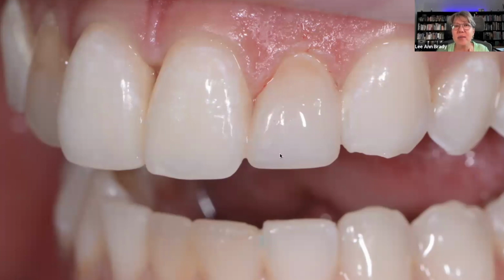Okay. And that it's not a sharp line across, right? It's got that character of dentin. You can see where I'm adding in surface morphology. She doesn't have a lot of natural surface morphology. So I'm just keeping this reasonably smooth. Okay. And then add that silhouette, that contour, and polish this up.